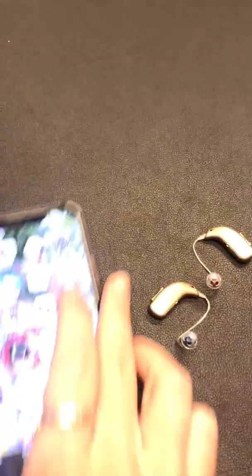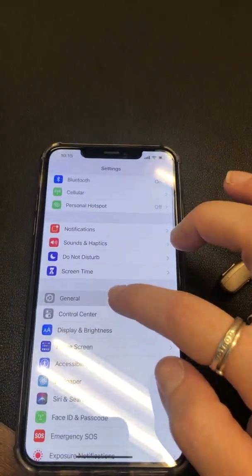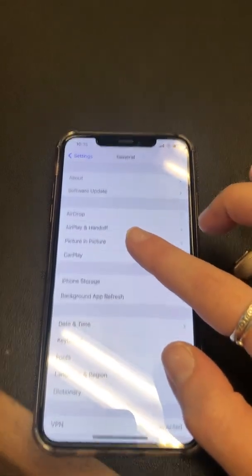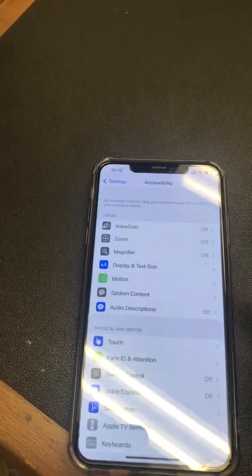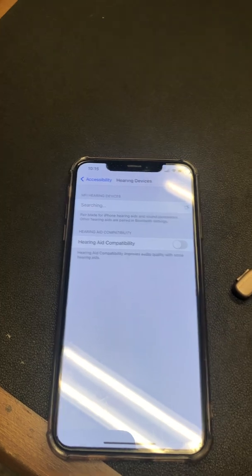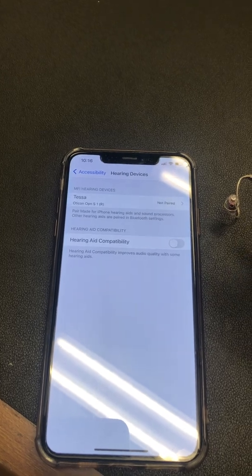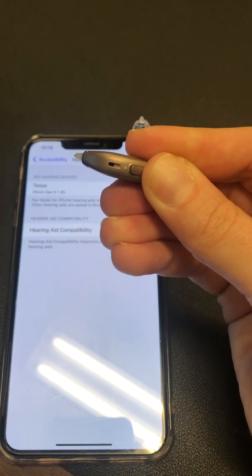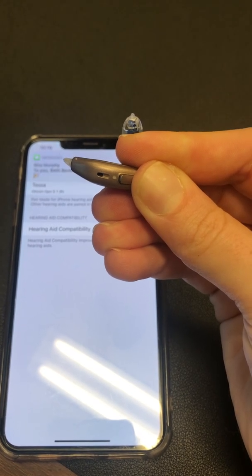On the Apple device, go to your Settings, then General — actually, go back out and go to Accessibility. From Accessibility, scroll down to Hearing Devices and it will start searching. It sees the right hearing aid but not the left, so I'm going to turn off the left and put it back in pairing mode so it can find both of them.